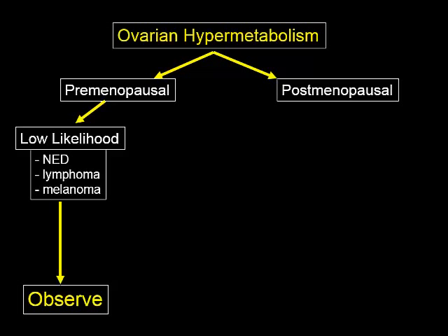If the patient is postmenopausal, and this may be related to the patient's age, but it's also possible patients can be postmenopausal on a chemical basis. And I learned this lesson the hard way from a young patient who had ovarian activity that I at first thought was physiologic, but the clinician called me back and said, I'm hormonally suppressing this patient, so she should not be having any ovulatory cycles. She should be essentially amenorrheic at this point, in which case she flipped over, even though she was only 20-something years old, into the postmenopausal side of this algorithm.